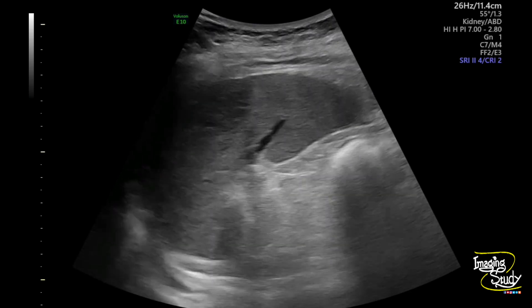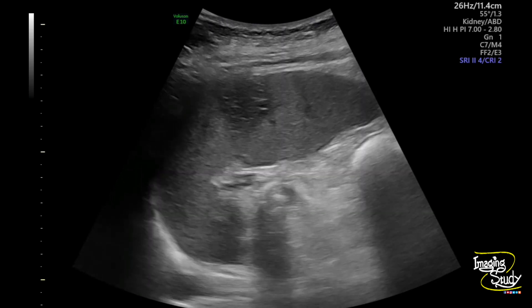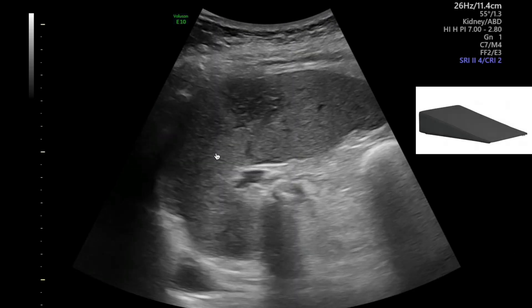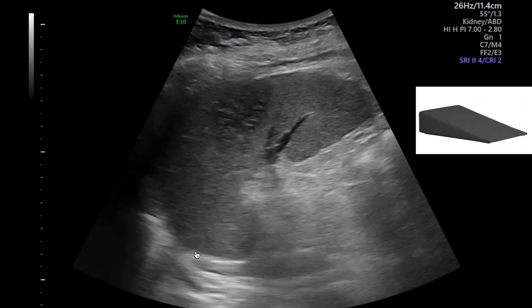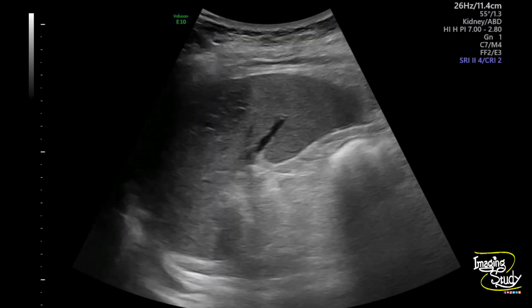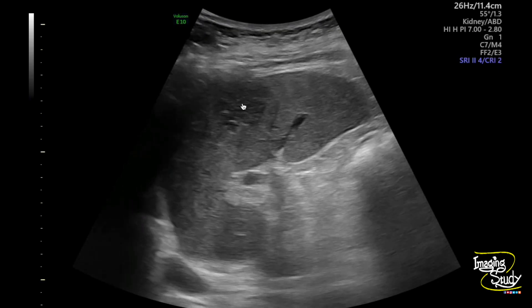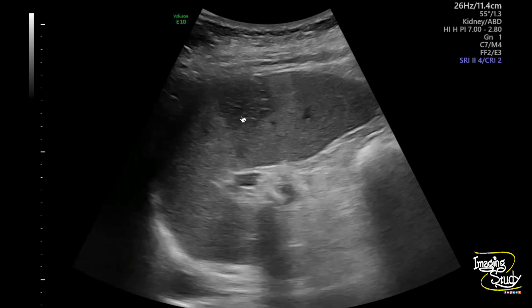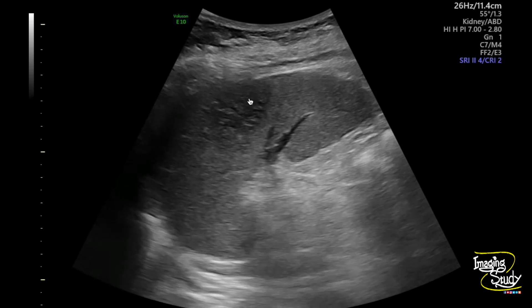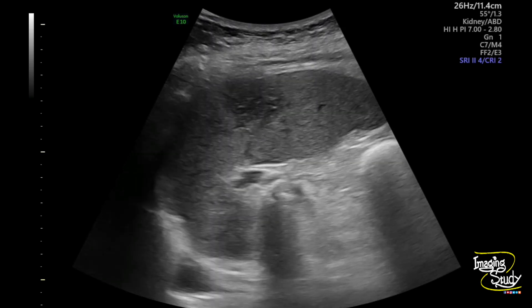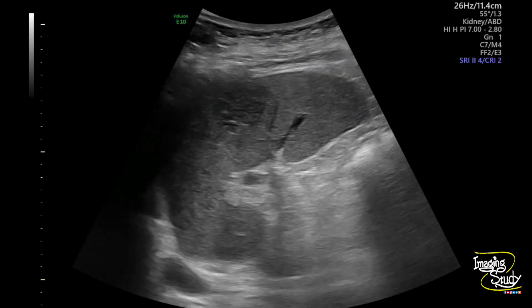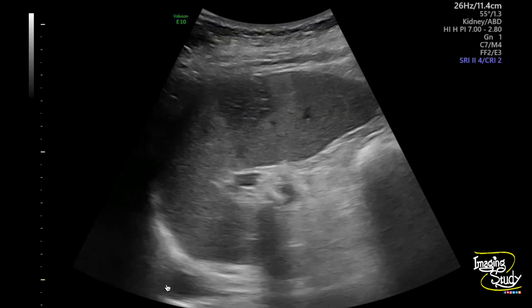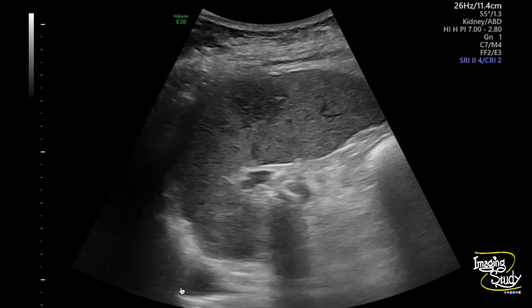I adjusted the contrast a little, and now you can see the lesion is hypoechoic. According to the book it might be called wedge-shaped. You can see some thin echogenic lines within this hypoechoic lesion — these thin parallel echogenic lines within the hypoechoic area represent the bright band sign, which is a sign of splenic infarct. If you look carefully, you can also see an anechoic area above the diaphragm representing left-sided mild pleural effusion.